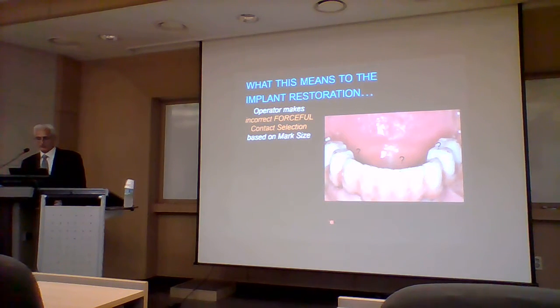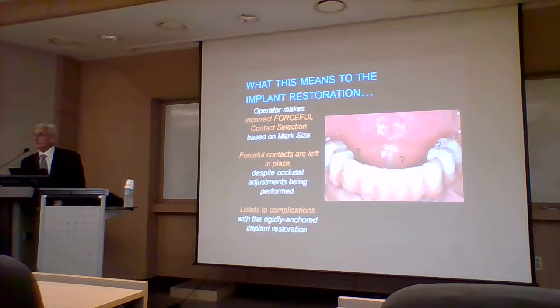He may not choose correctly, which means that forceful contacts are left in place at delivery because ink doesn't measure the force, and that leads to problems after insertion. 임플란트가 이제 아까 위에를 봤던 것처럼 그 교합 로딩하면서 프레셔 주는 거, 프레셔가 이제 걸리는 거 굉장히 중요할 텐데 교합지만 가지고 있을 때 그걸 갖다가 알기가 쉽지 않은 한계점들이 있는데 이제 있음에도 불구하고 이제 날마다 영상에서는 뭐 알 수 있죠.